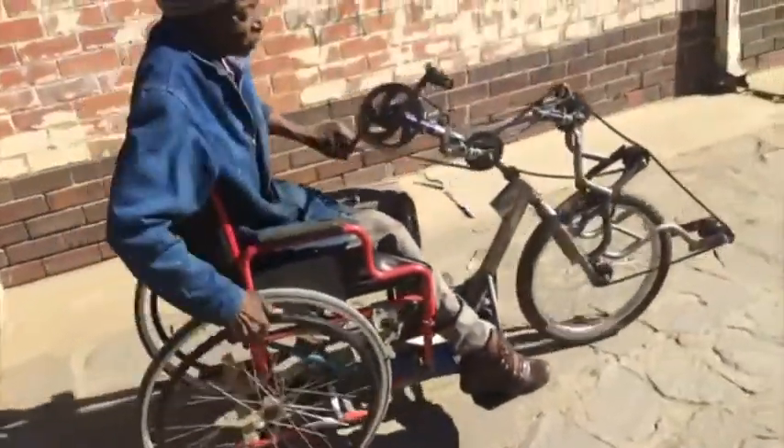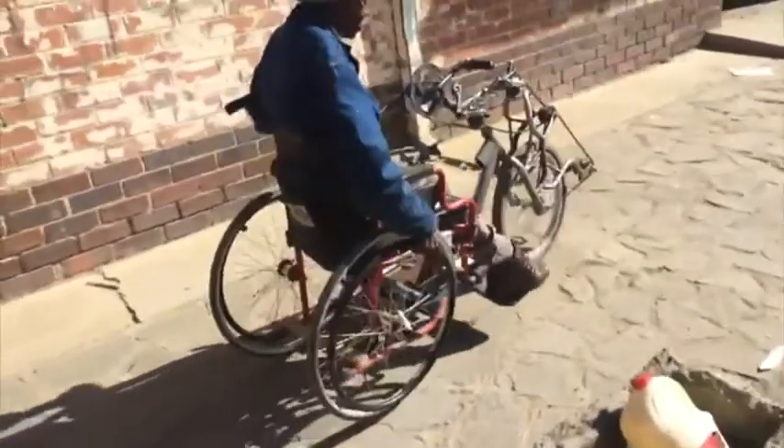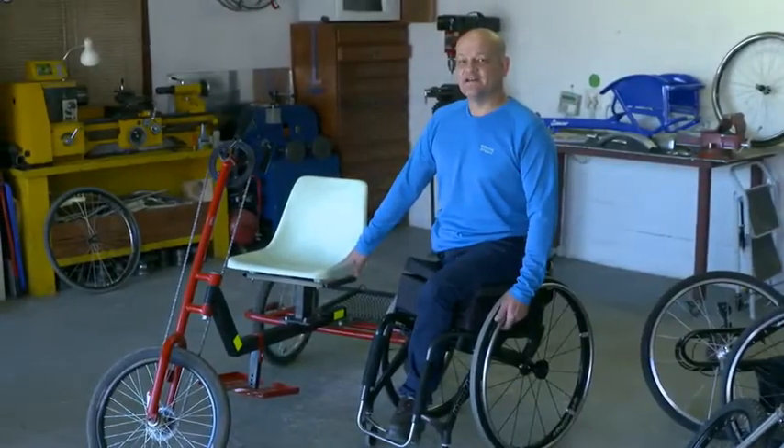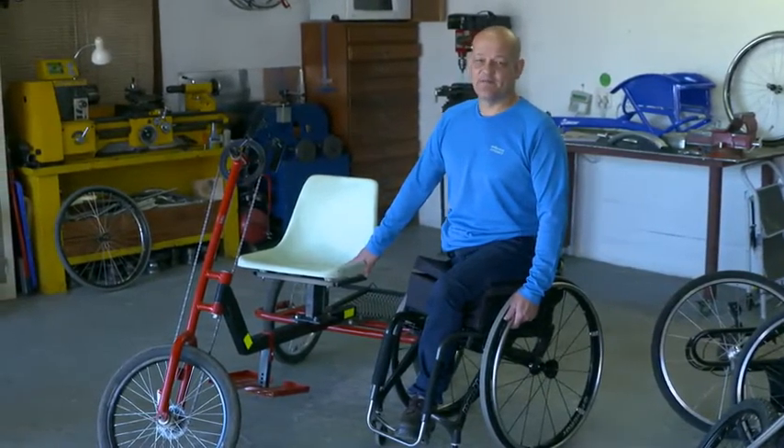I've noticed a huge problem in the rural areas with mobility. The areas are not very conducive for people in wheelchairs, and I came up with the idea to manufacture and design a rural handbike that will enhance their lives and make mobility for them much easier.